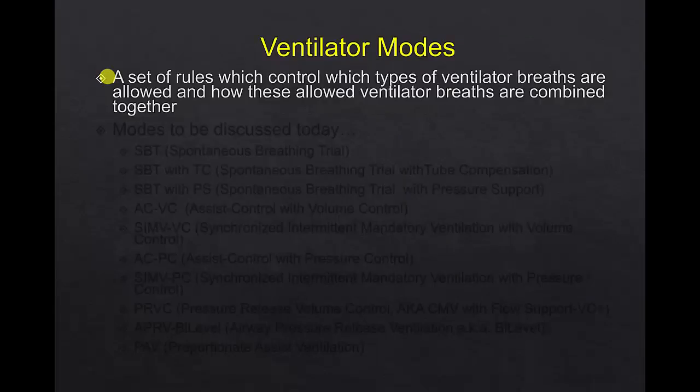So let's get started. Let's talk about what we mean by ventilator modes. A ventilator mode is a set of rules which control which type of ventilator breaths are delivered and how these are allowed in combination.